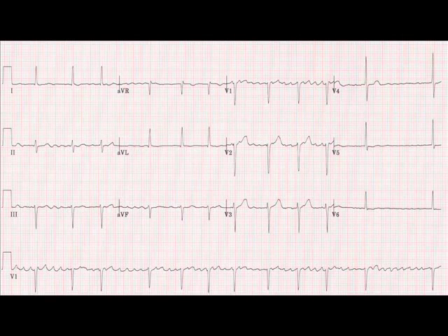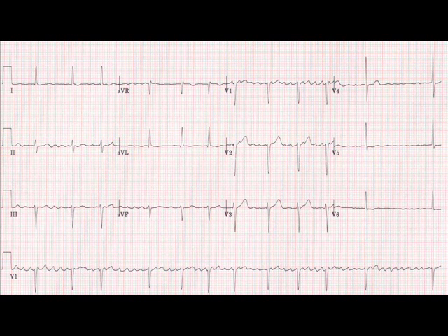Well, that's what you're looking at here. When you look at a 12-lead, it's quite useful to firstly look at the rhythm strip, which runs along the bottom of the tracing. You can see it there, labelled V1 on the bottom left. This is because when you're trying to ascertain what arrhythmia it is, you get more complexes than in the leads above.